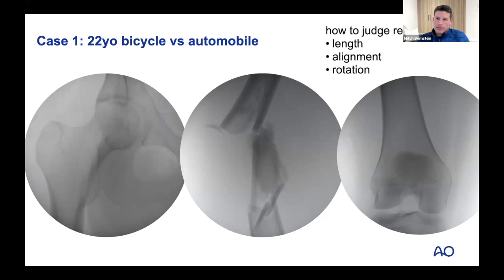Will the nail do this for us? Will the fracture table solve this for us? What is it that you need to do to plan and prepare for this? I was taught entry point and trajectory.